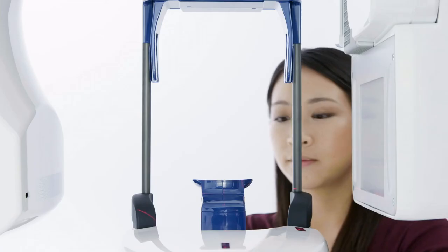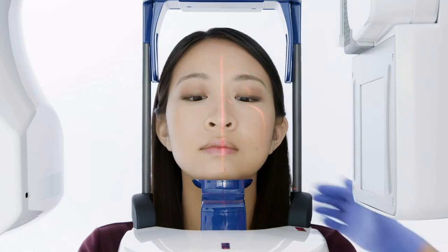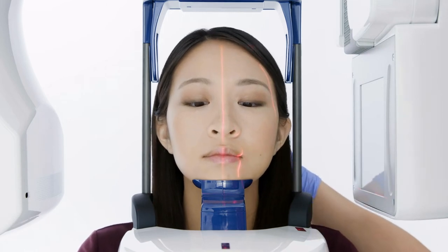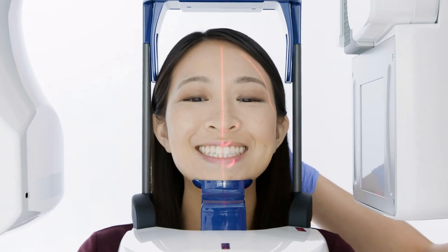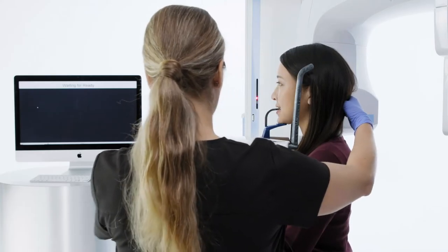Instruct the patient to bite on the bite stick and visually verify the upper and lower anterior teeth are in the grooves. The patient may also be positioned using the chin cup. The chin cup will keep the patient in occlusion.